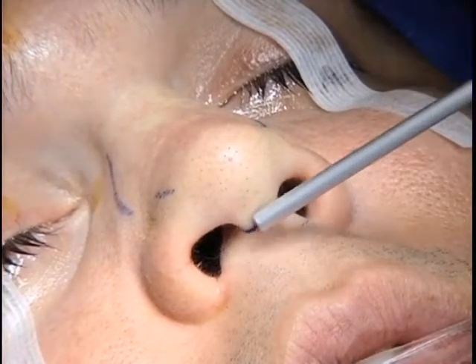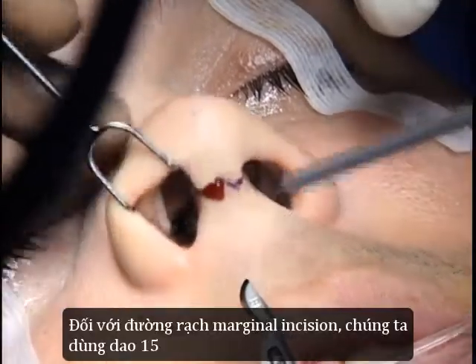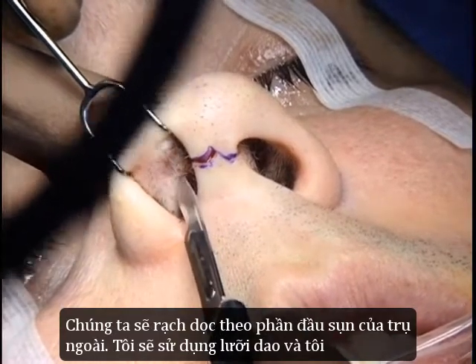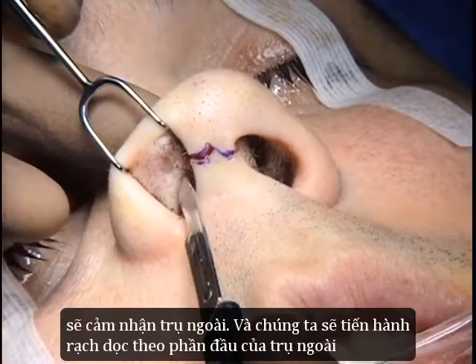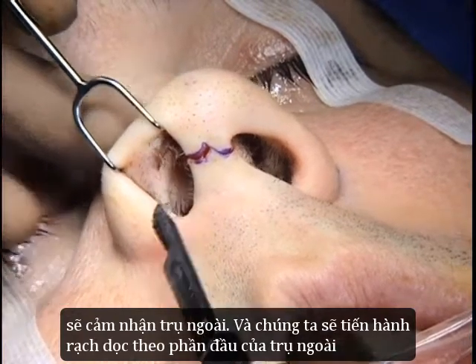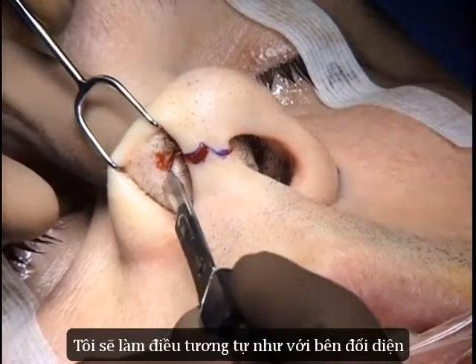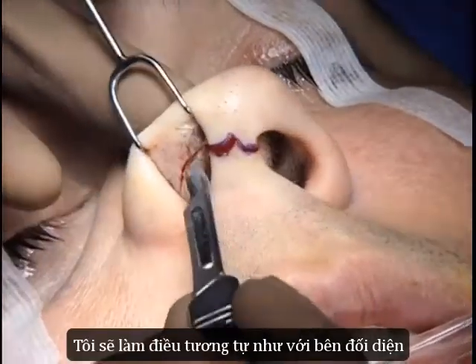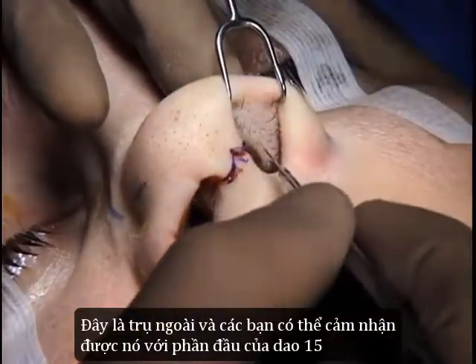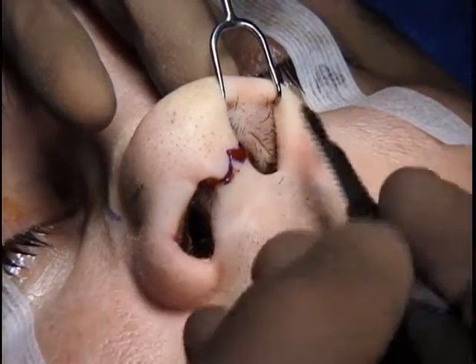And a 15 blade. Now we're going to make the marginal incision. So the marginal incision we make right along the caudal aspect of the lateral crus. I'm using this blade and I can feel the lateral crus right there. So we're going to go ahead and make the incision right along the caudal aspect of that lateral crus. I'm going to do the same thing on the contralateral side. Again, this is the lateral crus, the edge, you can feel it with your tip of your 15 blade.